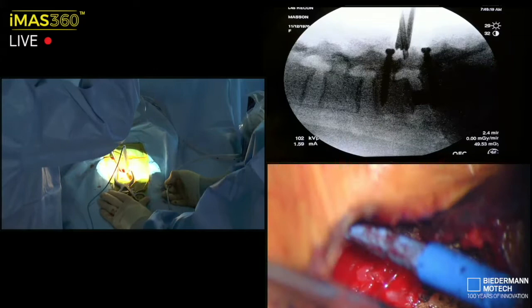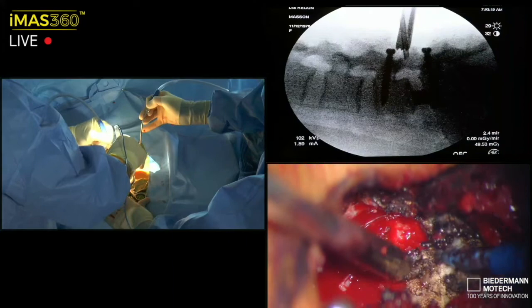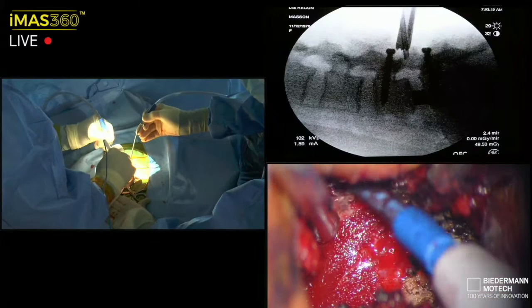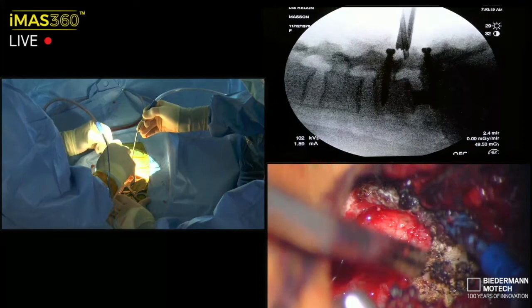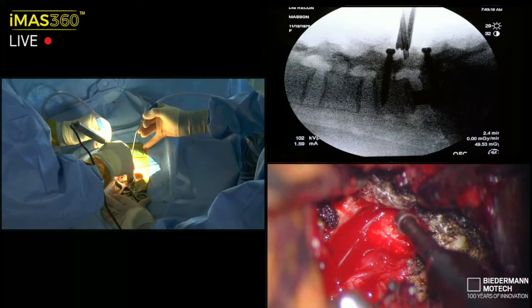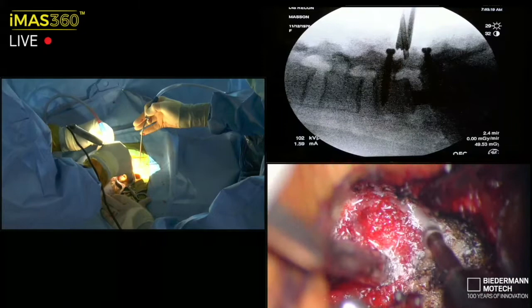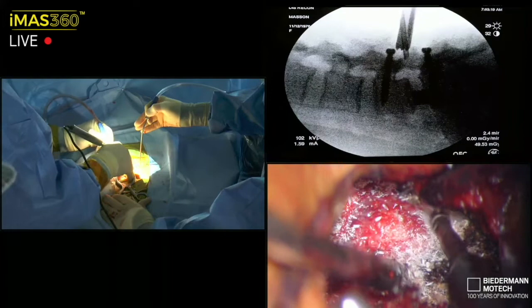All right, let's see if I can do this. Starting to fog up a little bit. As you start developing the base of the dorsal spinous process for the internal laminectomy, it gets easier and easier to see across midline. At the beginning, it feels like, wow, how am I ever going to get there? But that's why you've got to get all the roof of that visual plane dissected, so there's nothing obscuring your high visual viewpoint. And just have the confidence that you're heading in the right direction on the downslope of the contralateral lamina.